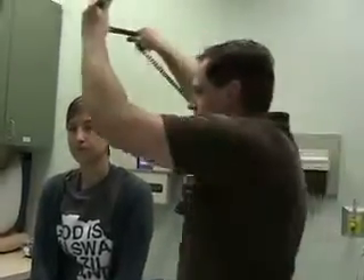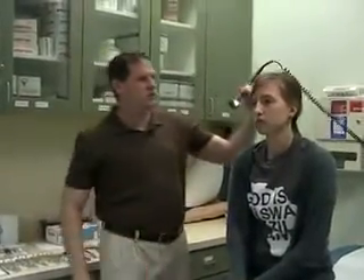We're going to do the other ear also. You can hold the otoscope one of two ways: you can hold it like a hammer, or you can turn it up and hold it the other way. If you hold it that way, you usually use your pinky and other fingers to stabilize it against their head. This is also useful if it's whacking their head — you can get it kind of up out of the way.